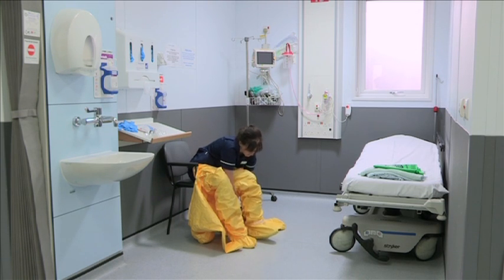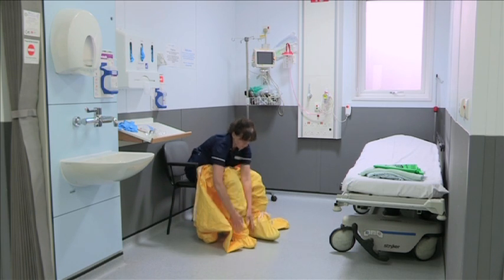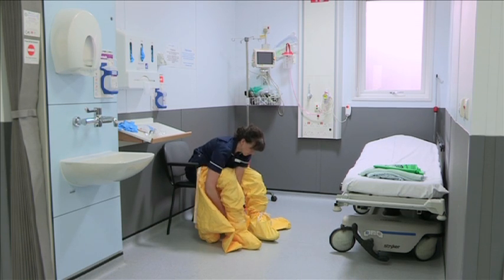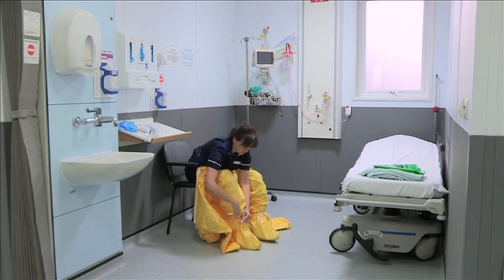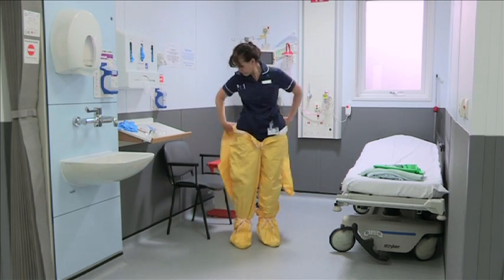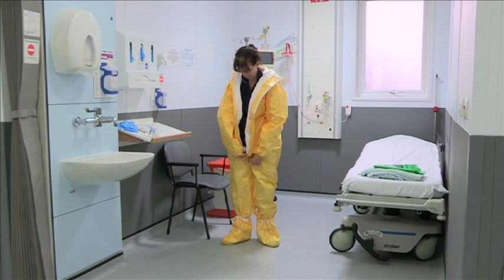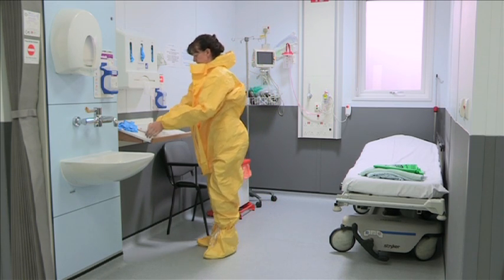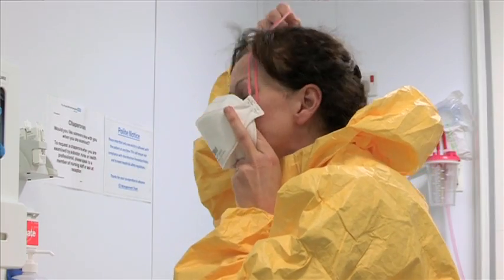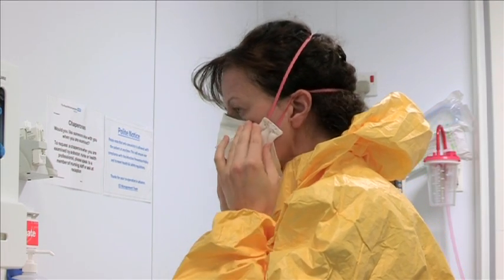Once booted feet are through the footholds of the suit, ensure they are tied securely on the outside of the suit's legs. Once the suit is on and zipped up, apply the FFP3 face mask. Ensure the straps are separated to secure the mask and that the mask is fitted well over the bridge of the nose.